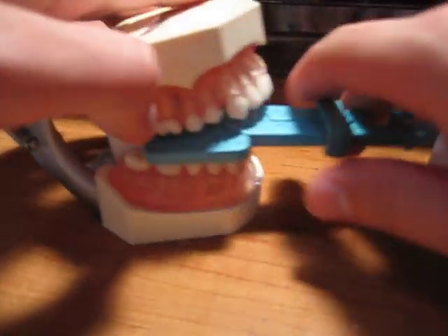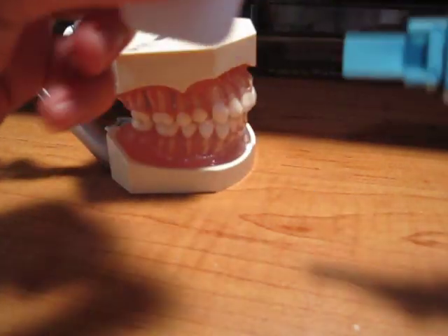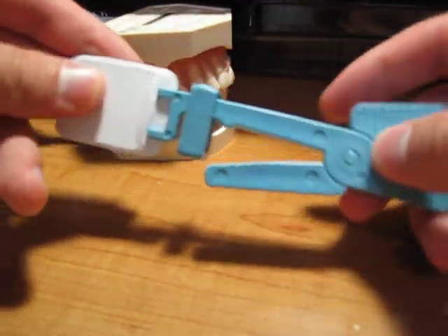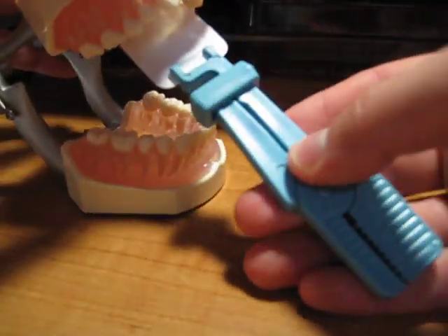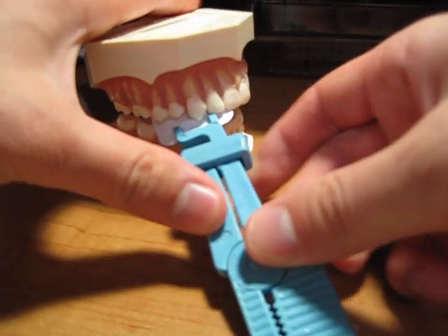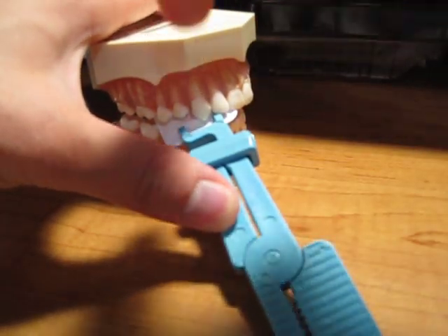Now for the front teeth, you will take the film, put it in the snap array like this, and the opposite end of it. Center this on the canine right here, have them bite, and the x-ray will come down this way right here.